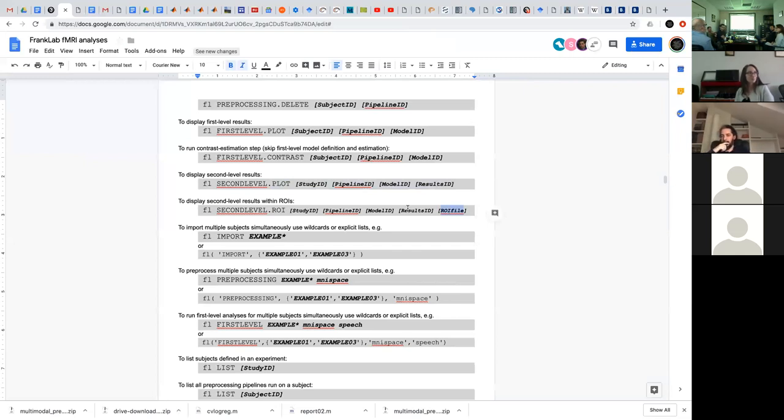I believe that except for this, some of the things that Elaine was going to test out, where we looked at subcortical ROIs that were derived from a probabilistic atlas or from an MNI coordinate with a sphere, all the other things we're talking about are individual ROIs. So even, you can make an argument that the ROIs... I remember, Alfonso, we had this conversation.